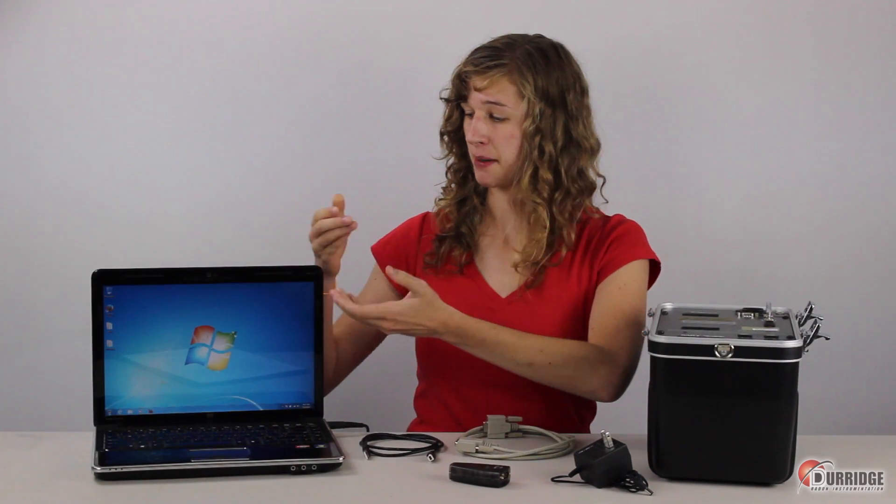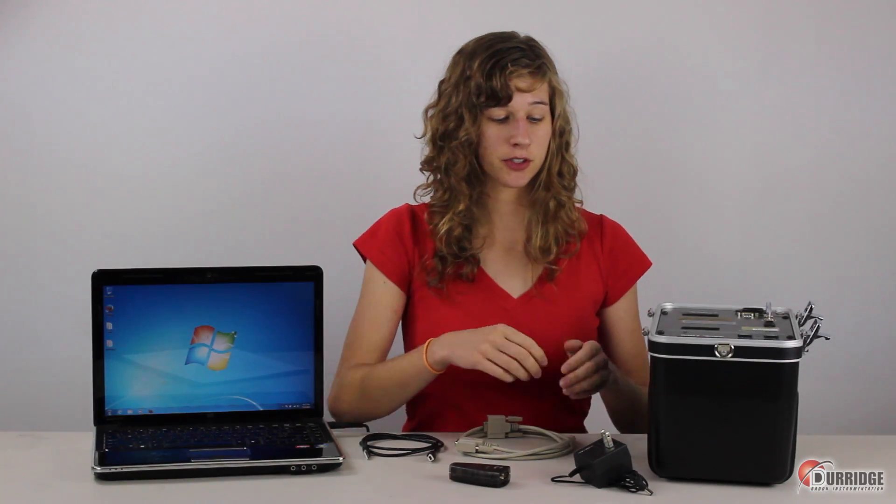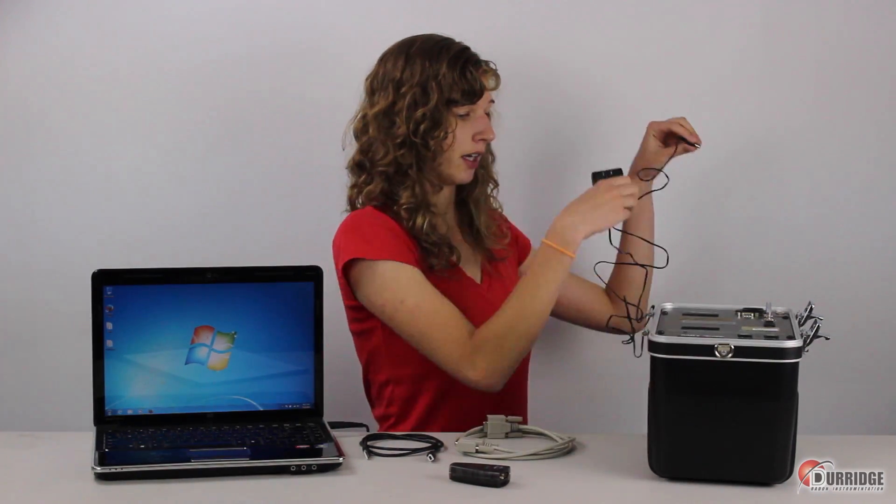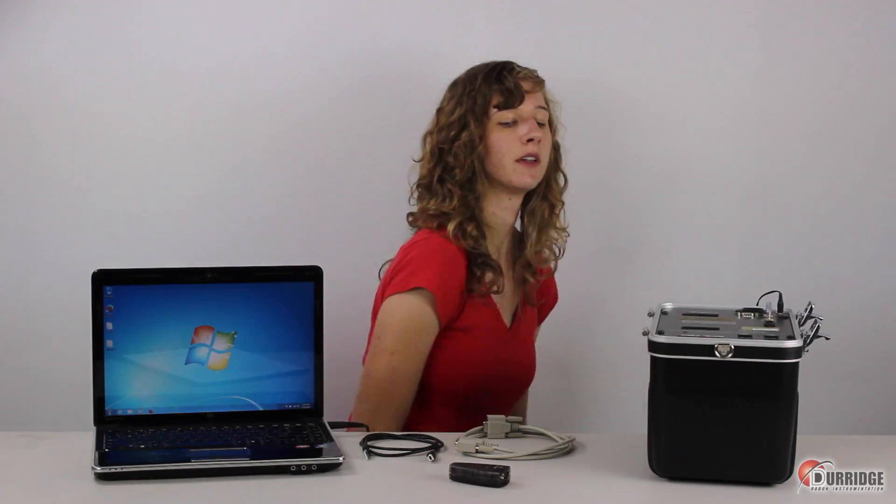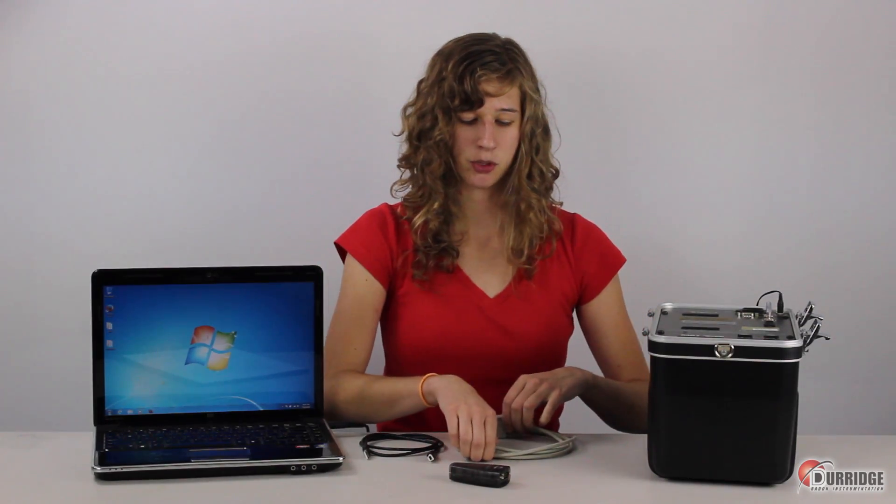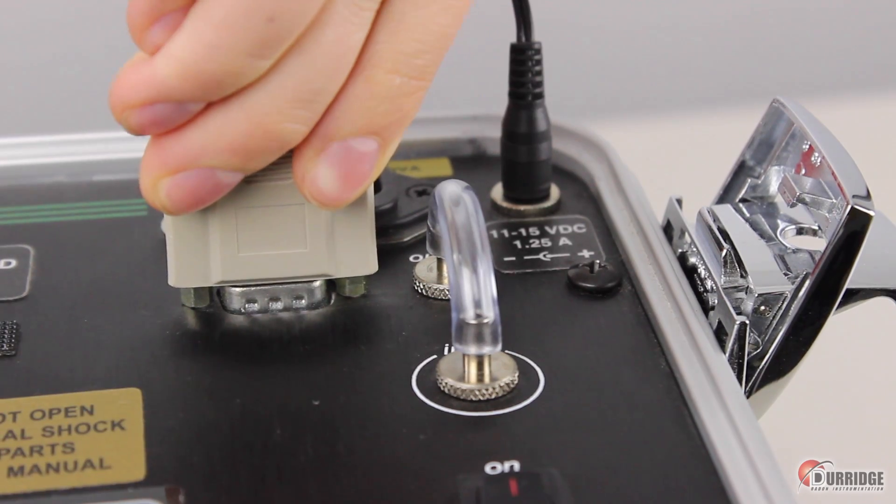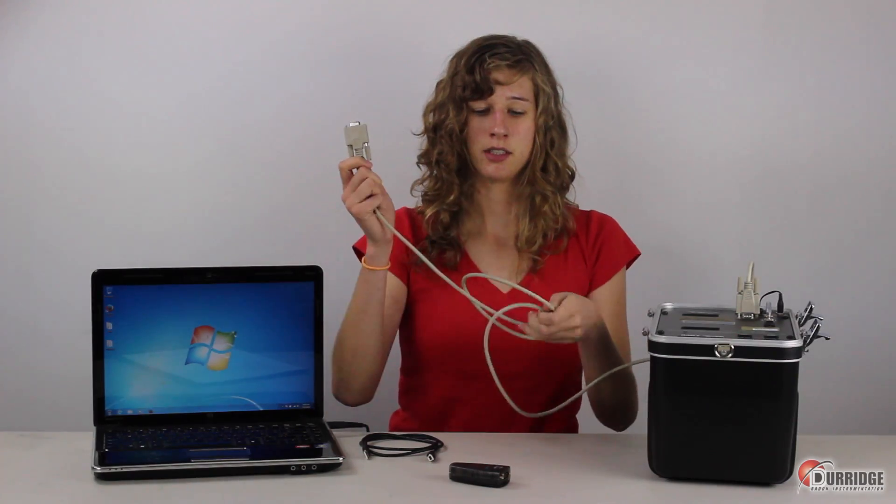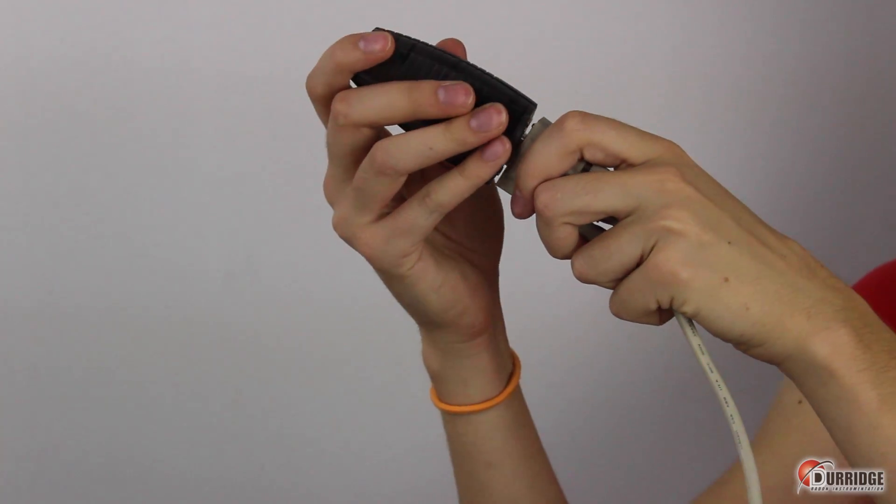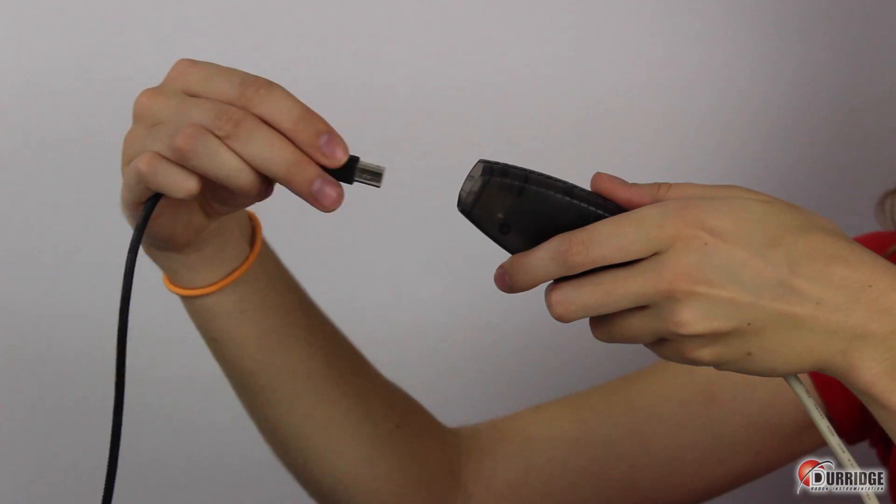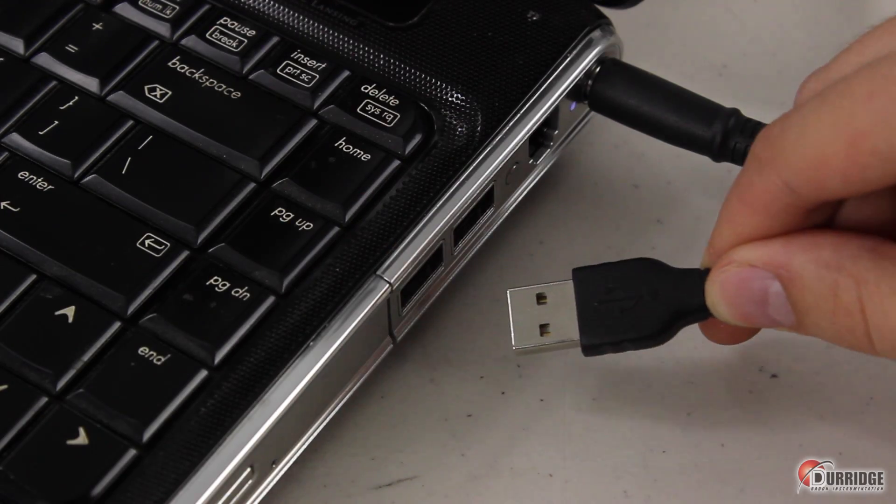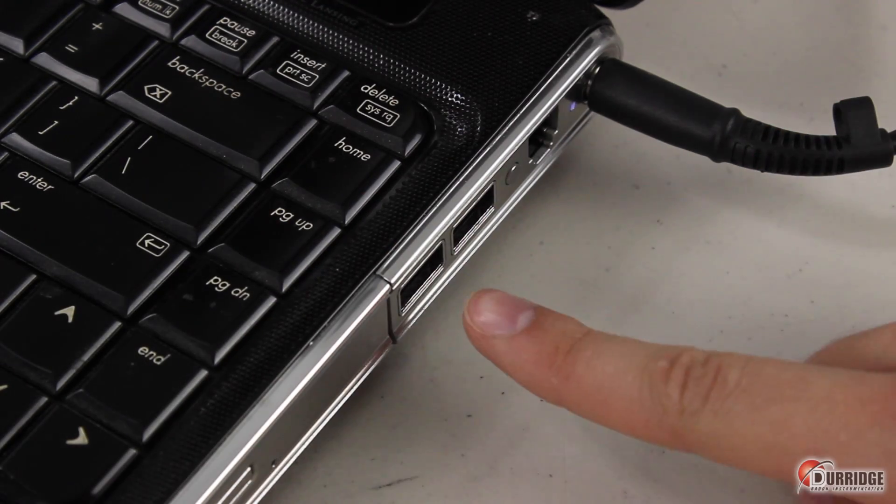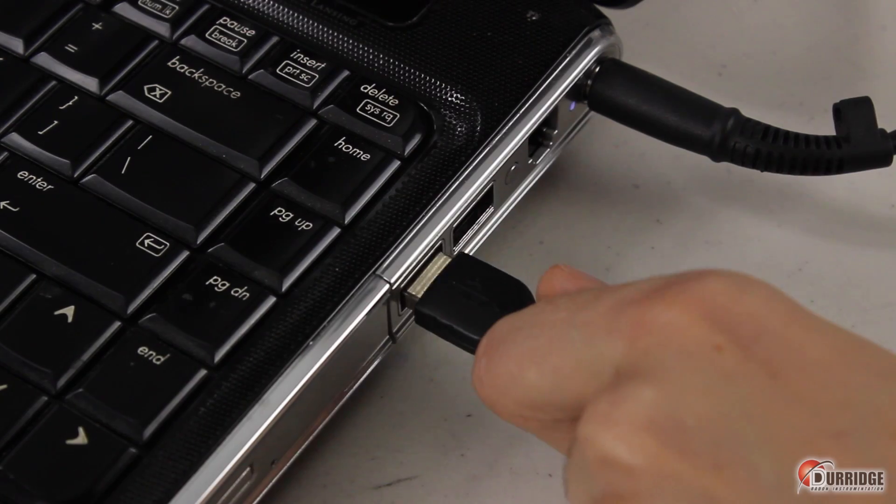Once you have Capture software and the Keyspan device driver installed on your computer, you can connect it to the RAD7. First, take the power cable and connect the RAD7 to a power source. Next, take the null modem cable and plug it into the serial port of the RAD7. Take the other end and plug it into the Keyspan serial adapter. Take the adapter and plug it into the USB-B cable. Take the USB end of that cable and plug it into the USB port of your computer. Now turn on the RAD7.